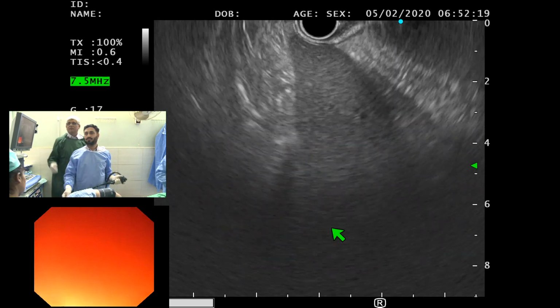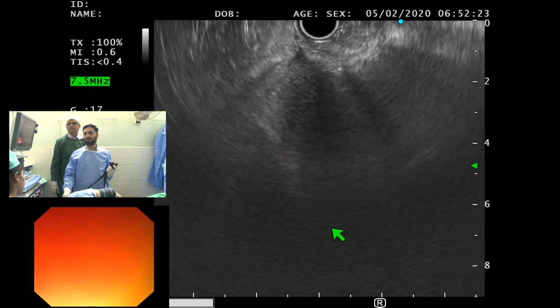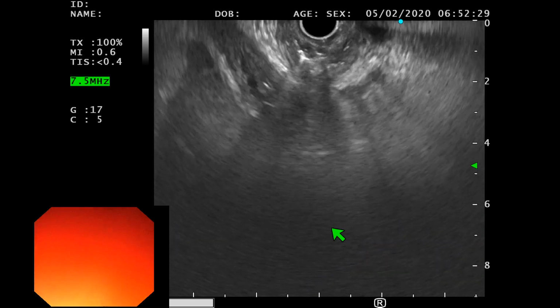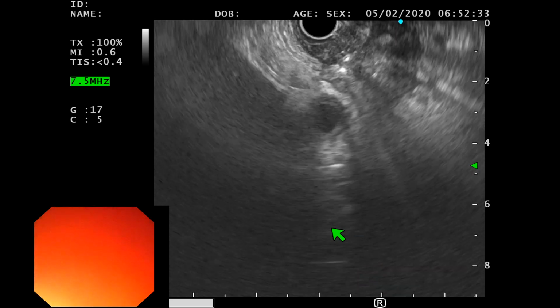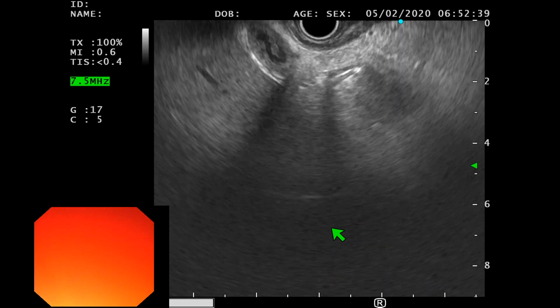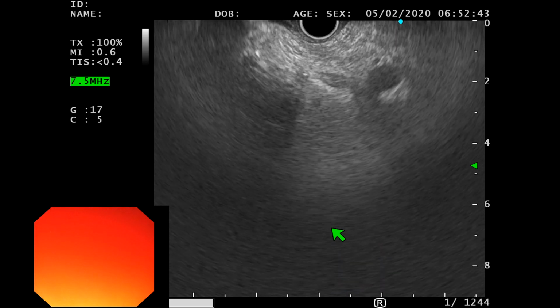Now, liver. So where are you now? We're still way in. Right. Come back a little bit more. Little bit more. Little bit more. Okay. Keep coming. Keep coming. Keep coming. What is this? Stop.